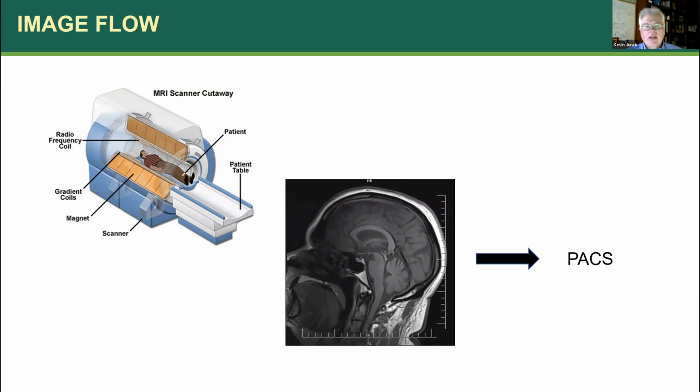Okay, well, now I've got some new artificial intelligence application, and I want to be able to send the images to it for, like we were talking about earlier, segmentation, or maybe it's going to do some type of post-processing, or it's going to analyze those images looking for some type of clinical finding, what have you. But the images have got to get there. Well, how are they going to get there?